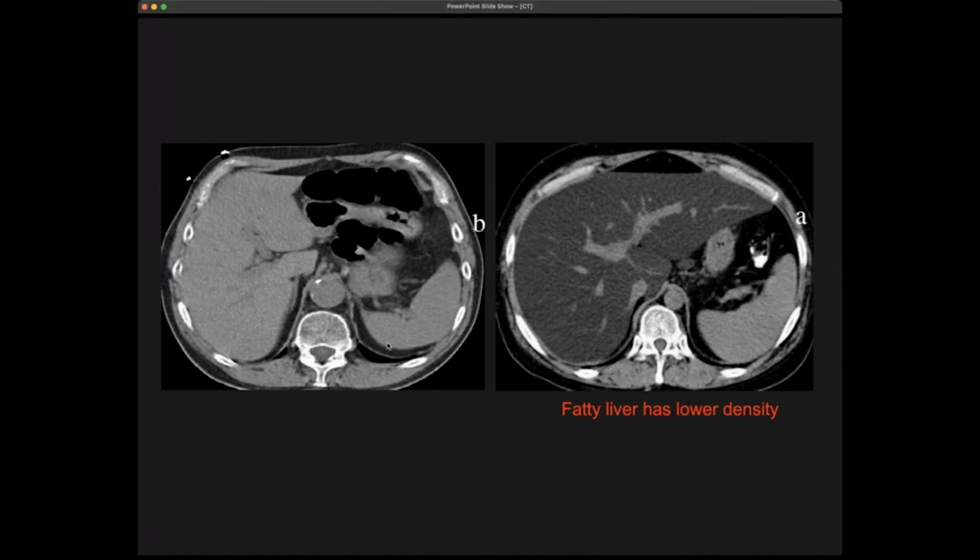Here's an example of an abdominal scan. Here you see a normal liver. As we said before, it's on the other side because you look from the bottom instead of from the top. Clearly again, you see the spine, the bone of the spine. You can also nicely see that the middle of the vertebra is less dense than the side. That's what's called trabecular bone. When you take bone, the inner part is much more spongy than the outer layer, and you can very nicely see that on these scans.